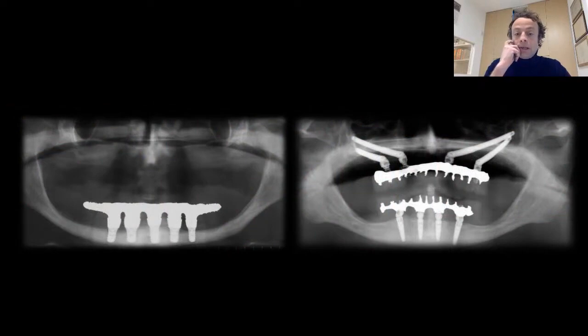And of course, in the upper, sometimes we also have the zygomatic implant. That is another option. It is an option that is really limited to the situations where all-on-4 and zygoma and also intrasinus implants are not possible. And I'm sure that Dr. Enrico Gagliardi will show you in his lecture a really well-detailed lecture about how to consider which kind of surgical approach to select in each clinical situation.